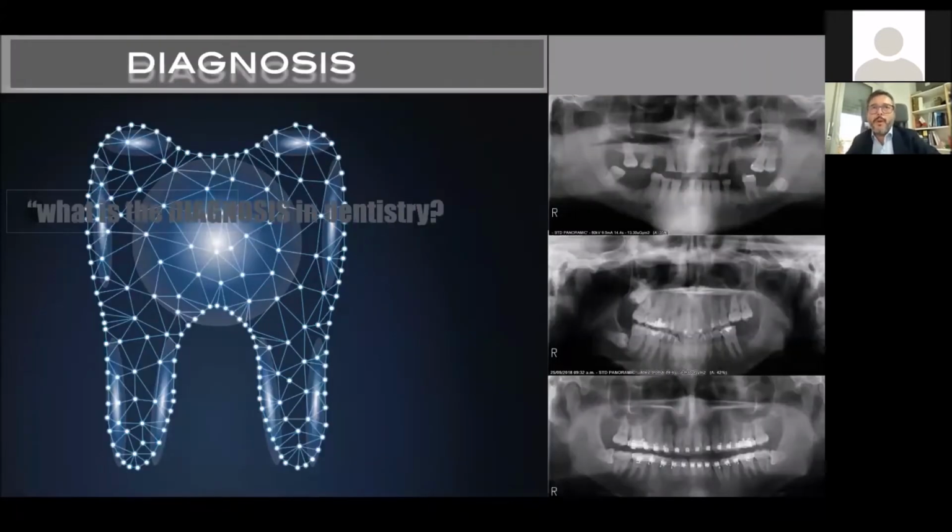Dental radiography is one of the most important tools available to the dentist. Many dentists are familiar with intraoral radiographic techniques, but are still unsure as to the interpretation of these films. A knowledge of normal radiographic anatomy is essential to correct diagnosis of disease and for monitoring disease progression. Moreover, many dental procedures can be performed only under radiographic control, and checking adequacy of procedure and outcome of treatment also heavily relies on radiography.